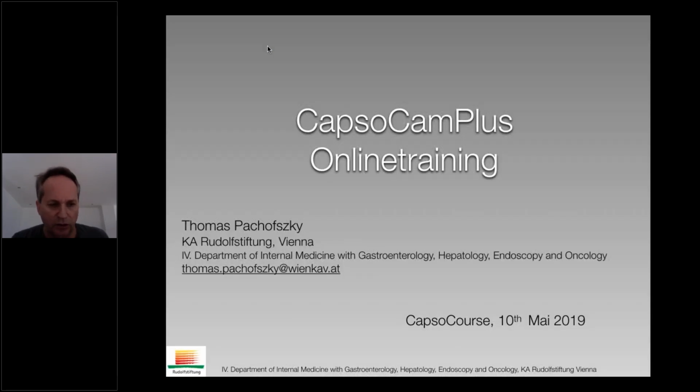So as Srini told you, I'm not only working with the CapsoCam. I started in 2003 with the PillCam. In those days, it was called M2A. Now we have the fourth generation, the PillCam SB3, and we're working with this system, also with the MiroCam, the new double-headed capsule, and the preferred system in my unit is the CapsoCam, and I will show you why we use it as our preferred system.